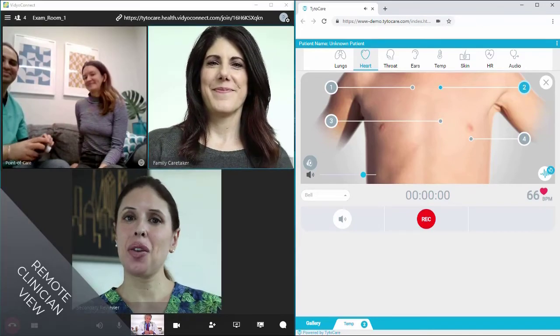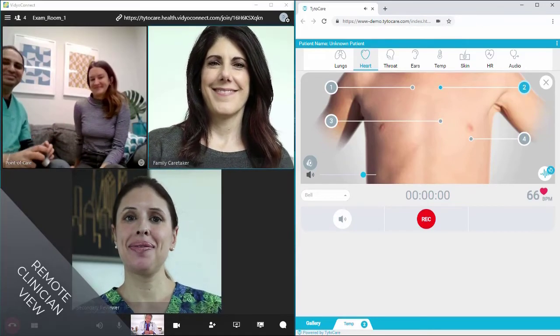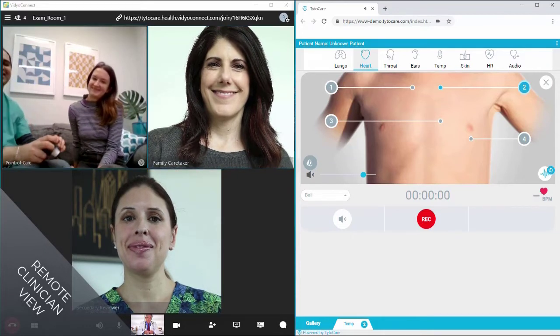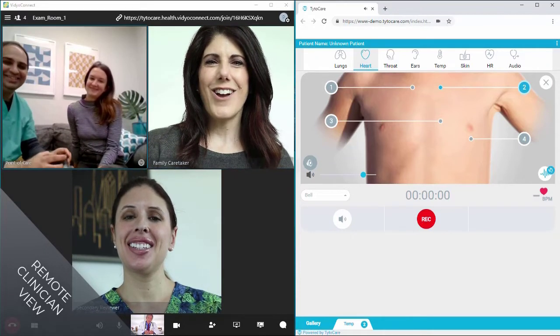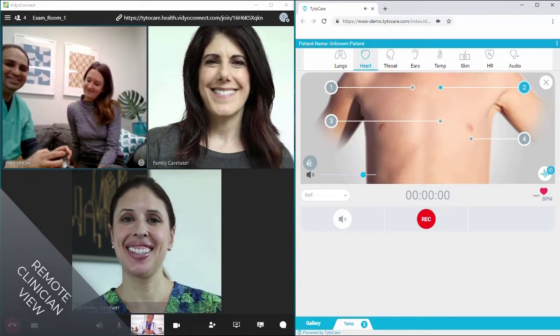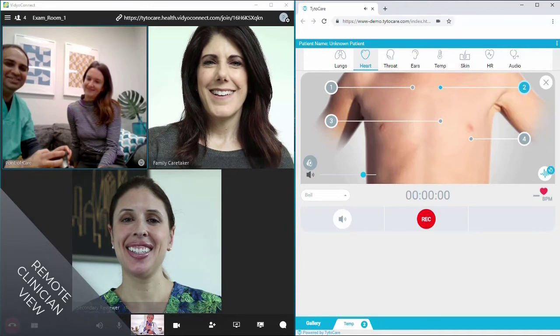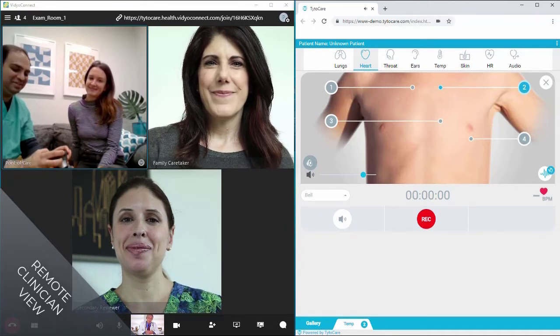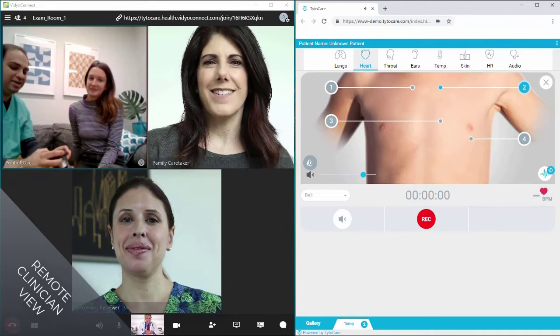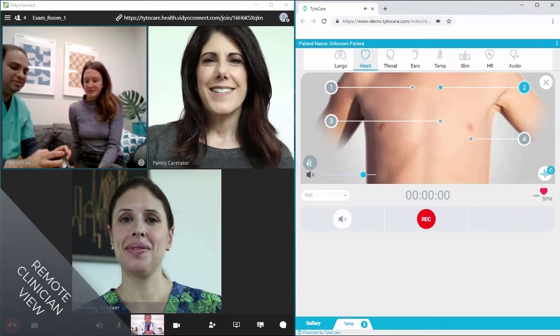The multi-party functionality also allows additional family members to join and participate in the assessment. When the clinician ends the Tytocare exam, all parties can disconnect and conclude the visit.